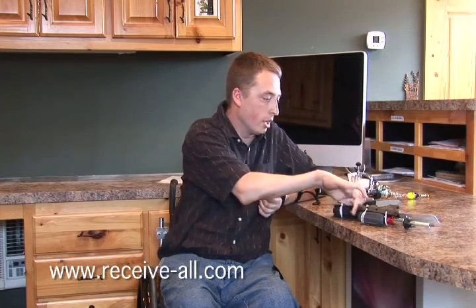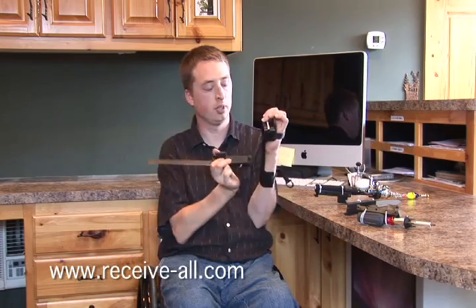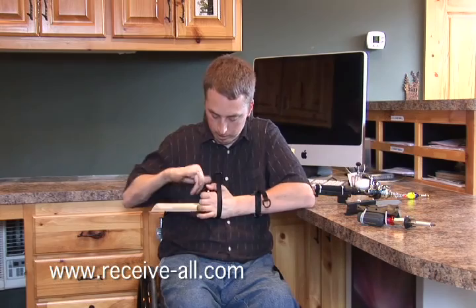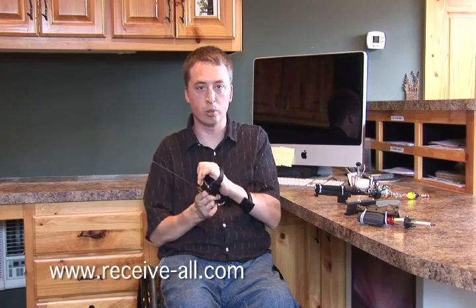Also, I have a different knife that I have ready to go. These are knives I just pulled from my kitchen. They were already set up like this. This bigger knife I used for cutting up a pineapple by myself, which would be extremely difficult and probably unsafe for me to do without this special equipment.